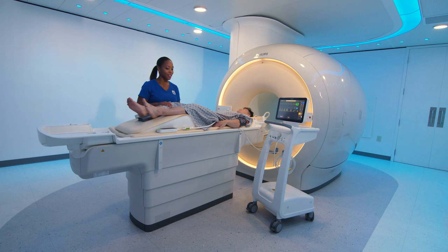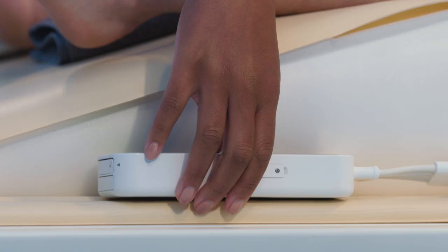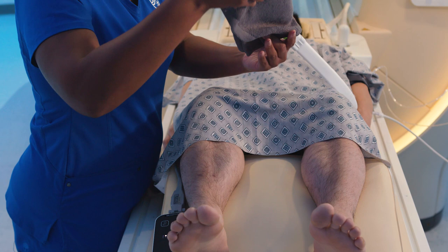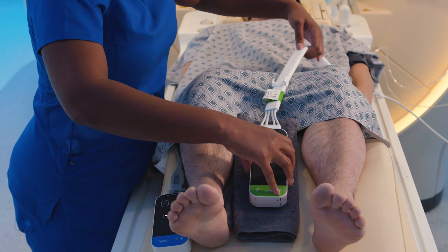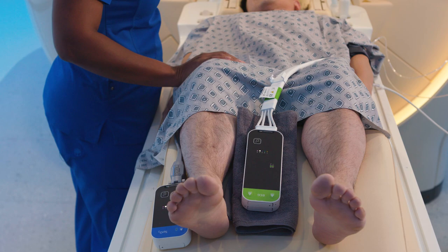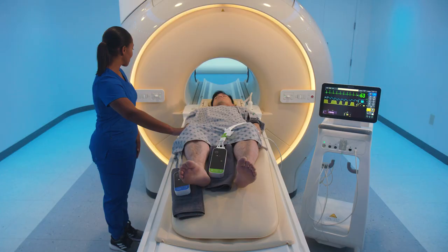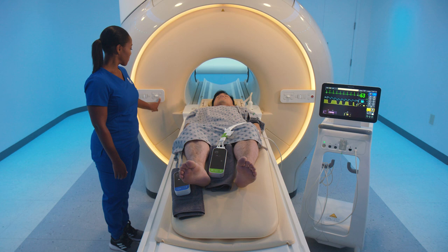Finally, before the MR scan begins, place the ECG module on or near the patient as close to the bore isocenter as possible, considering the scan to be performed. Place the ECG module outside of the bore if possible. If the modules can be placed outside the bore, positioning at the bore isocenter is not necessary. Keep the wireless module outside the field of view. Place the ECG module on a cushioned surface, such as a washcloth or towel, to minimize MR vibrations.